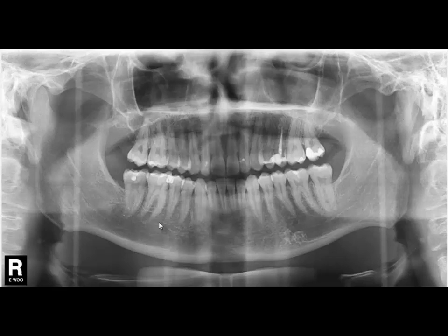So this is a normal OPG. Now let me show another OPG.